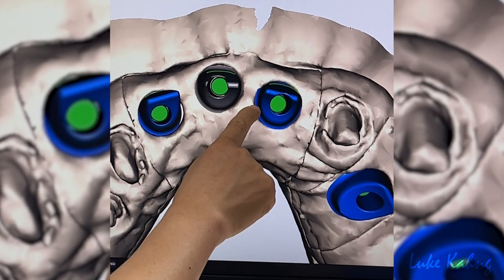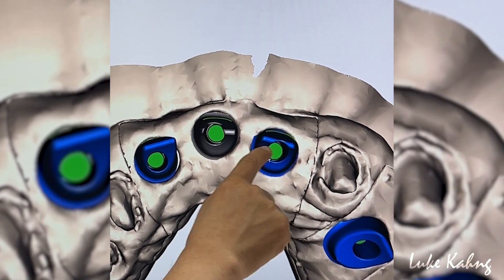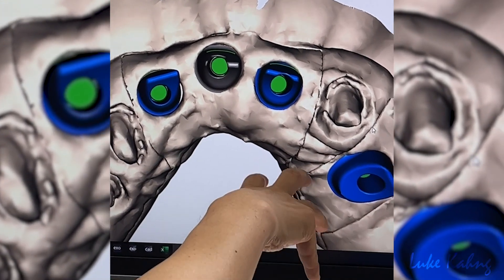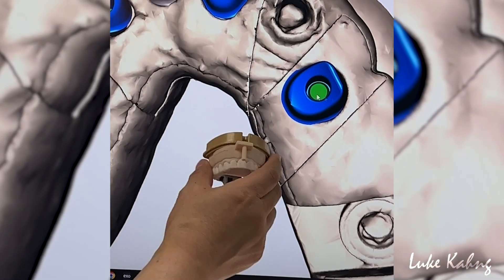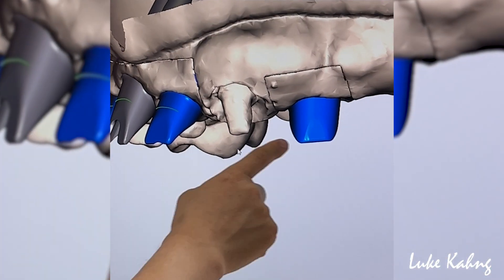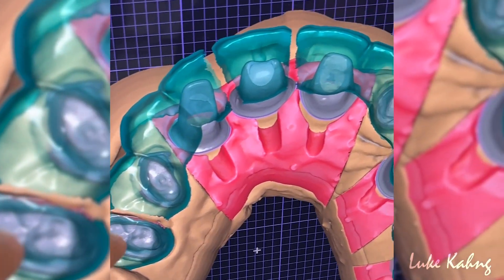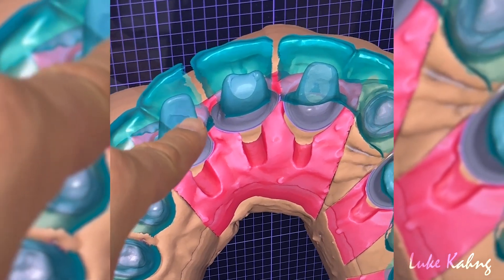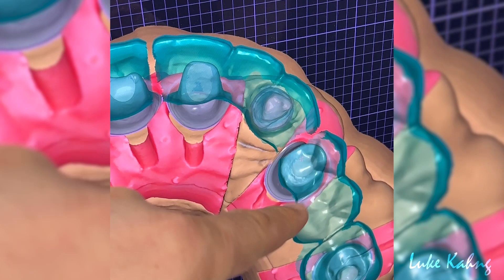More cut here. It's more of like a base? Yes. Okay, more cut in visual distance because this is the aesthetic zone. Same thing too. Occlusion. Frontal view. Maybe two — I'm going to check later after you change this. So we're going to make the 3-unit bridge, because the preparation is a single 3-unit bridge.